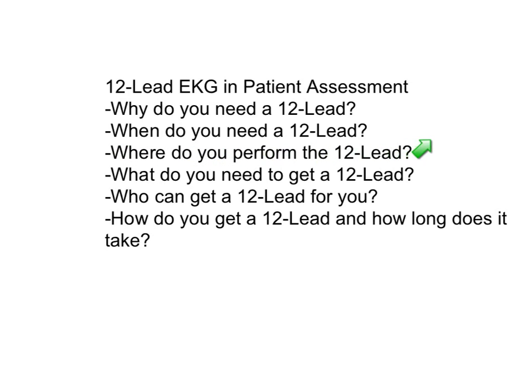Where do you perform the 12-lead? It should be wherever you need it. You can certainly do one quickly in the house. If you begin treatment in the house, you can do one in the ambulance. When the ambulance is moving, you're going to get a little bit more artifact sometimes, a little bit more motion. But again, you can time that and work on getting your 12-lead when you come to a stop, when you're going to listen to lung sounds, or when you're going to get another blood pressure.